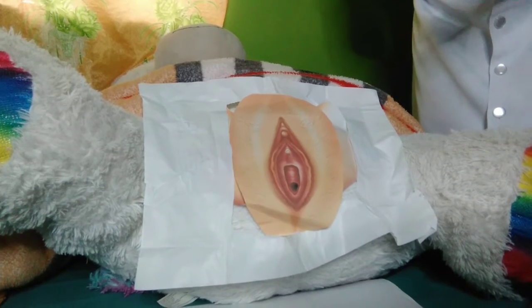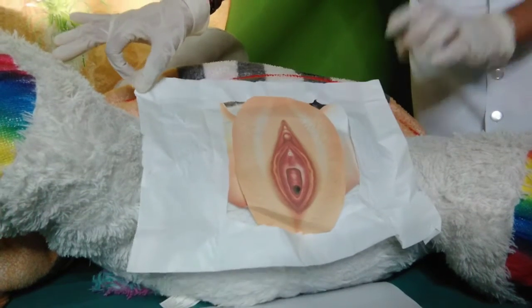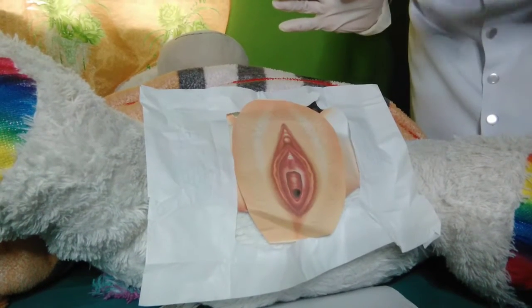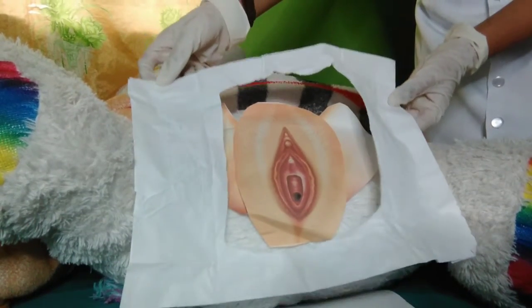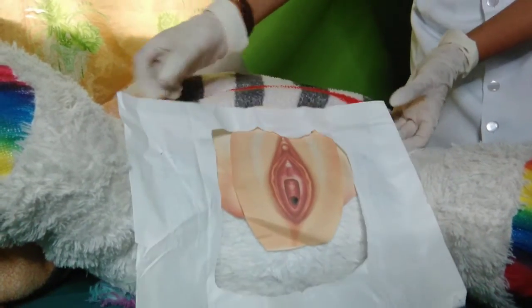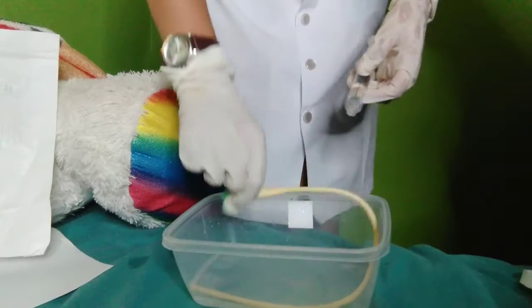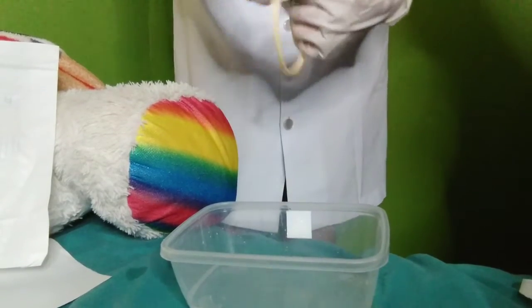Drape the patient to expose the perineum. The outer 2.5 cm is considered non-sterile on a sterile drape. Cover the patient with the sterile drape. Using a sterile syringe.